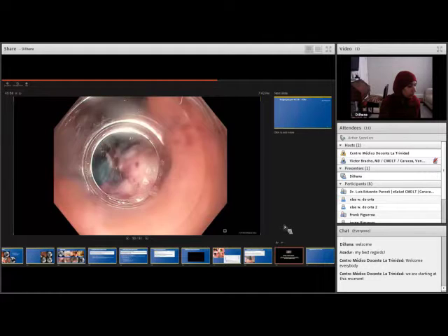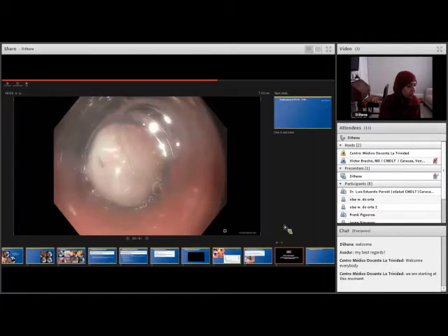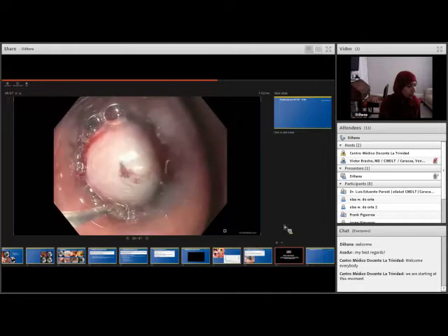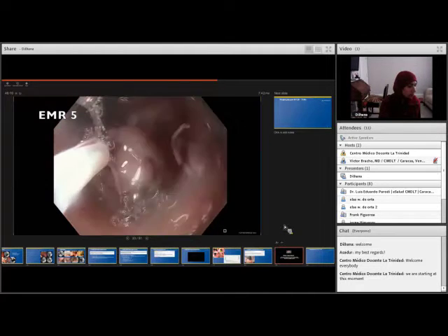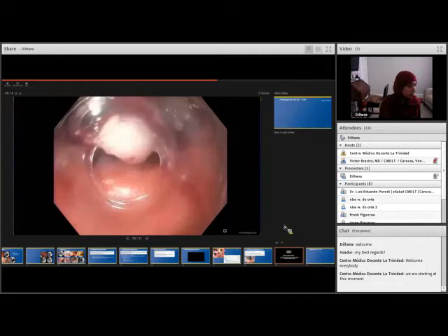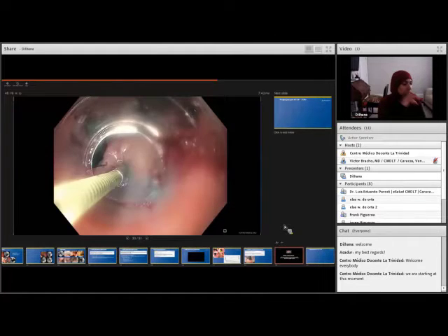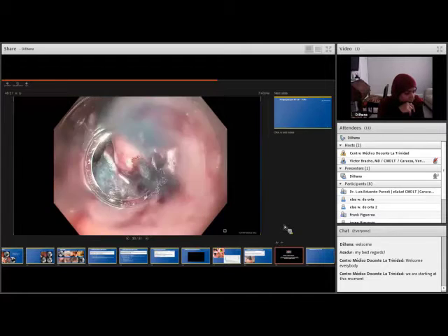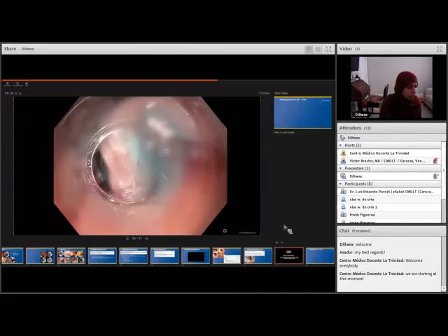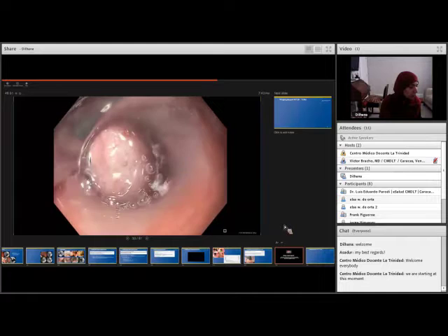There are several reasons why we switched from the band to the CAP EMR kit. The band EMR kit allowed for a smaller amount of mucosa to be resected, and thus was more time-consuming, leading to a longer procedure time, and it proved difficult to maneuver the injection needle and the snare through the banding cap. When performed without the band EMR kit, we were able to resect larger pieces at a time, thus reducing procedure time, and it was much easier to maneuver the snare into position for the resection.